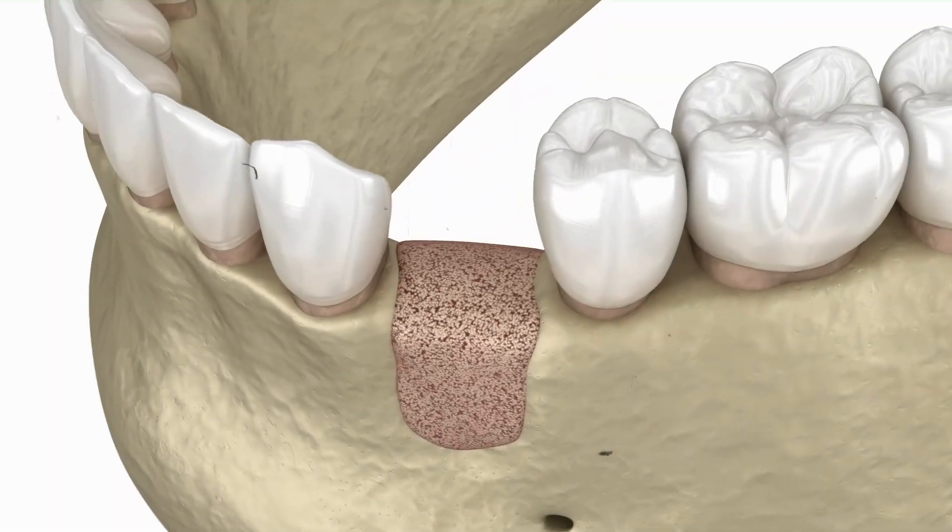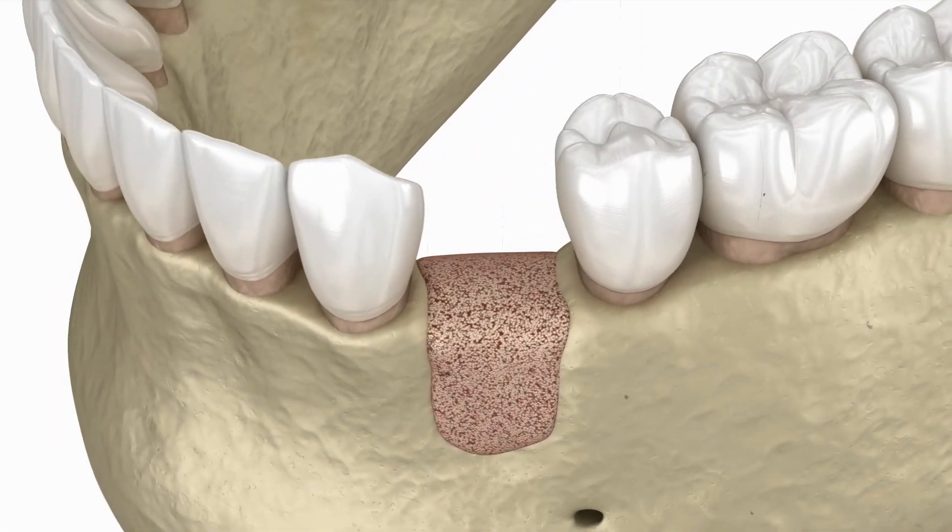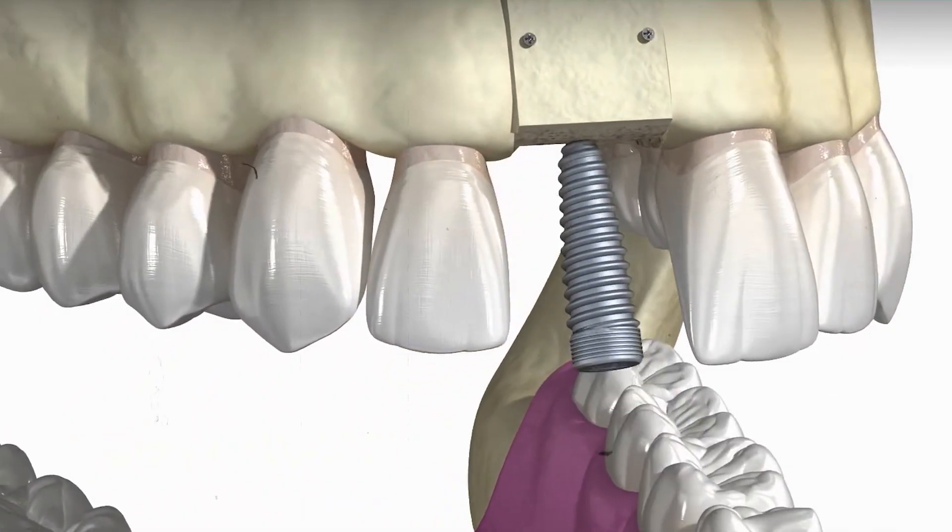After some time, the bone graft heals and integrates well with the rest of the jawbone, making it ready for the dental implant.